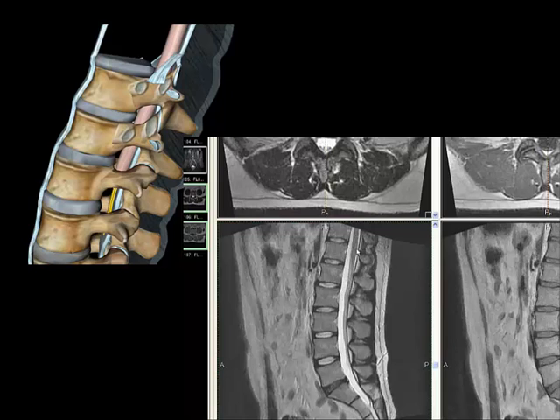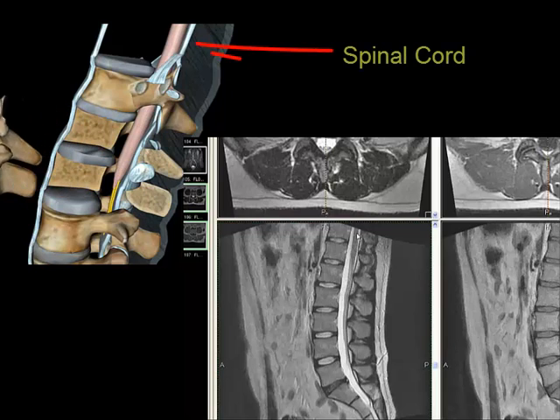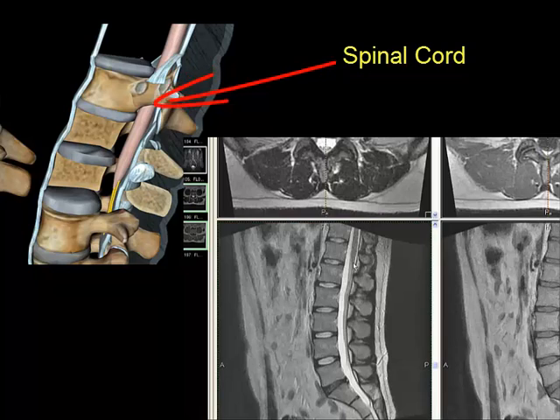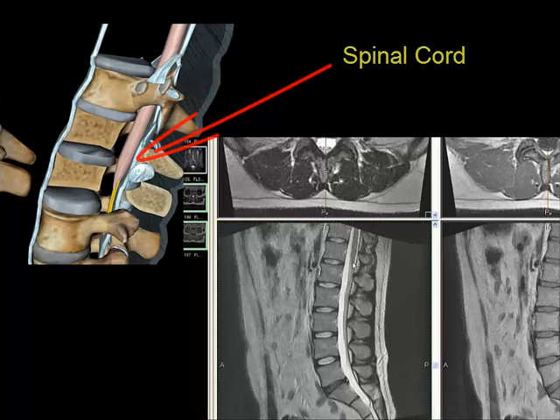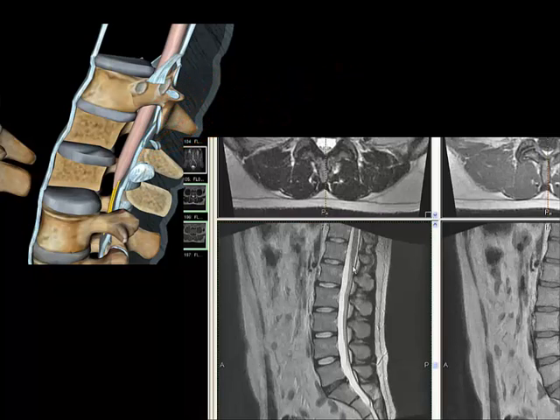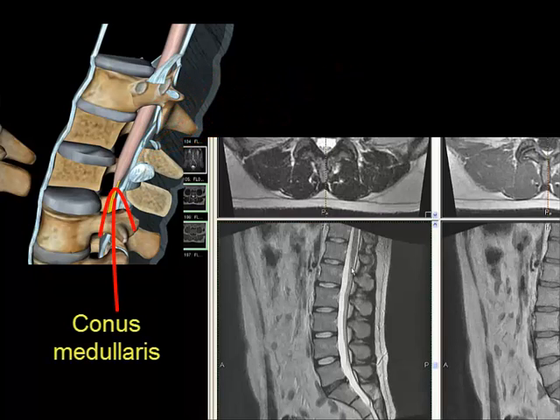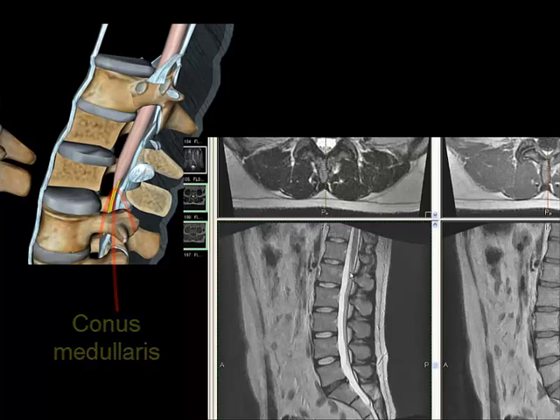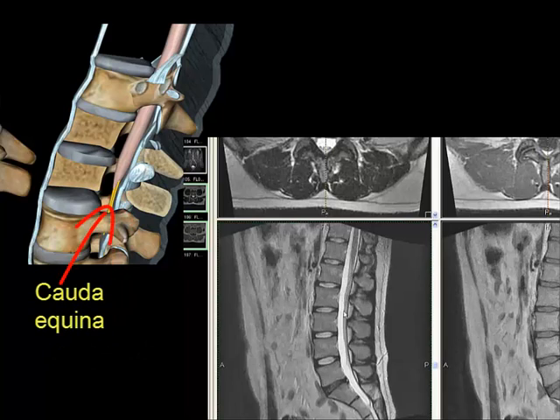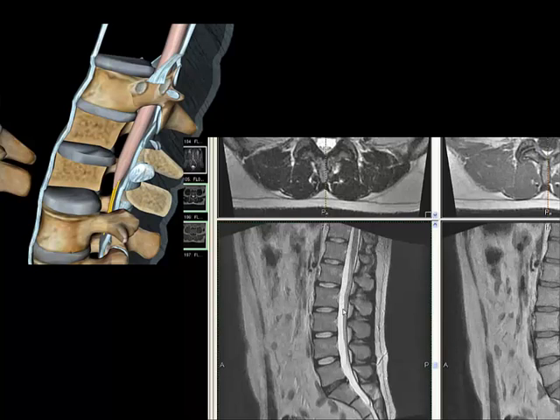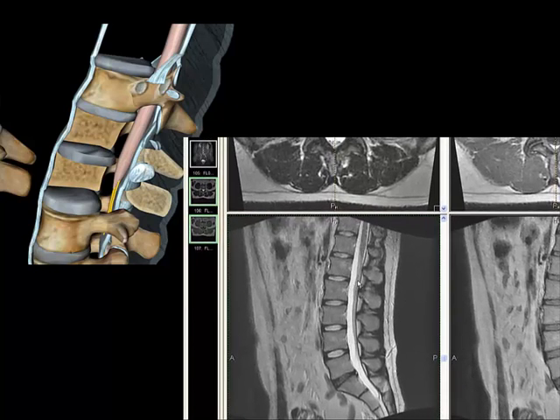Once we enter the thecal sac, we can see the spinal cord here. The tip of the spinal cord is the conus medullaris here. And then the nerve roots that descend from that is the cauda equina. You see them on the posterior aspect of the thecal sac because the patient's laying on their back and gravity pulls them that way.